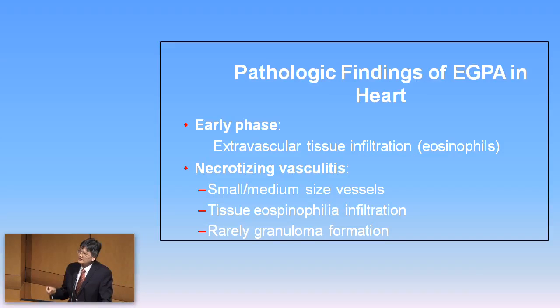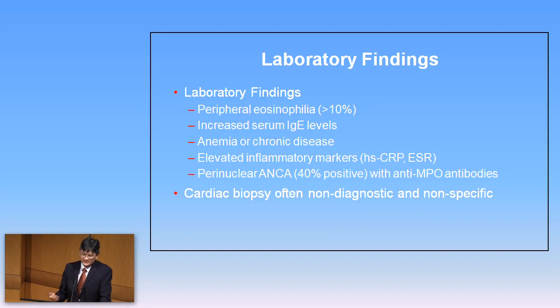And in addition, I think eosinophils can come and go actually quite often. So a case like this, usually most of the time we get it in autopsy cases. Certainly we see clear eosinophil granules, but most of the time when we do biopsies in people with a known diagnosis, we see fibrosis and myocyte necrosis with a lower prevalence of normal myocytes. So in the early phase, we see extravasation of tissues, and then subsequently there is some replacement fibrosis and small to medium-sized vessel changes that our pathologists usually describe.